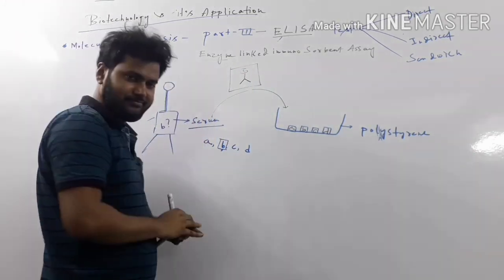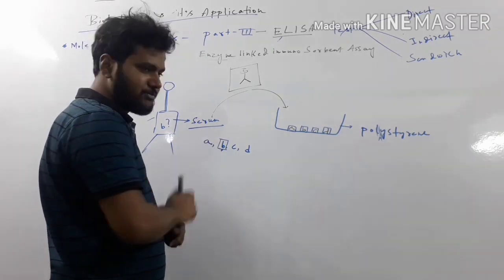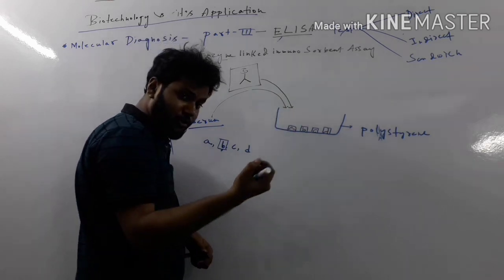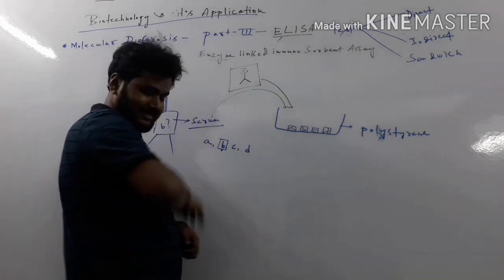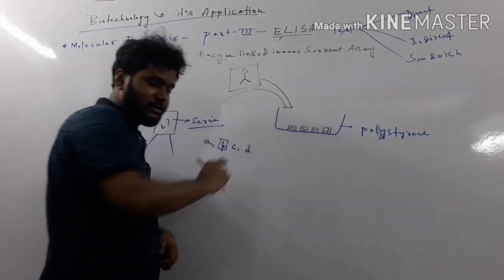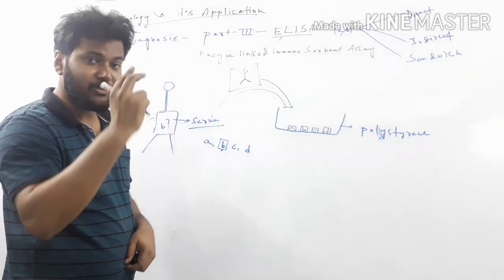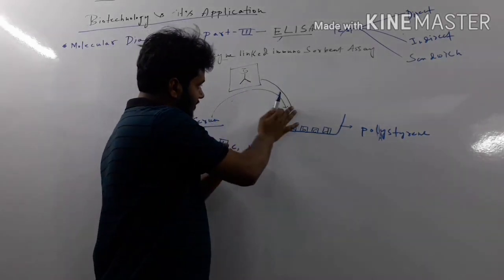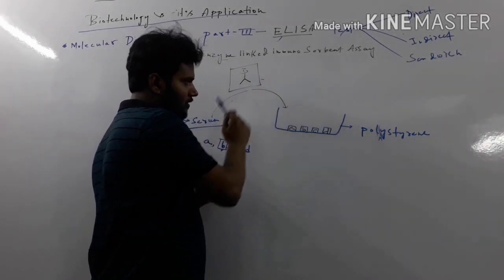This is pre-formed. Now what do we have to do? We have to pour this reagent here, but before depositing this reagent into this plate, we have to do two important procedures. What do we have to do? First, we're not giving it right now.